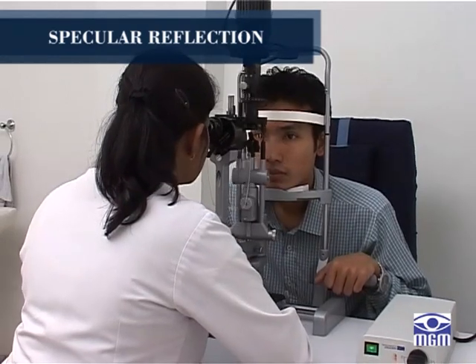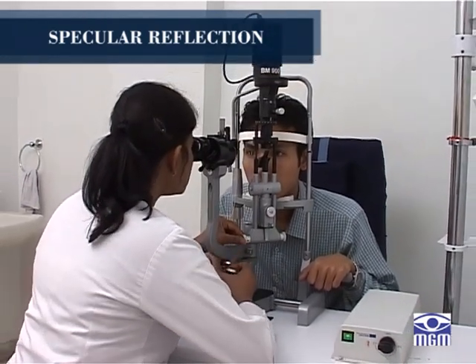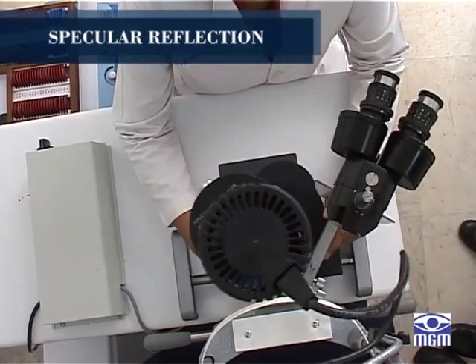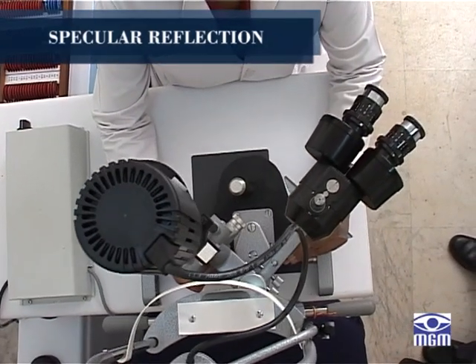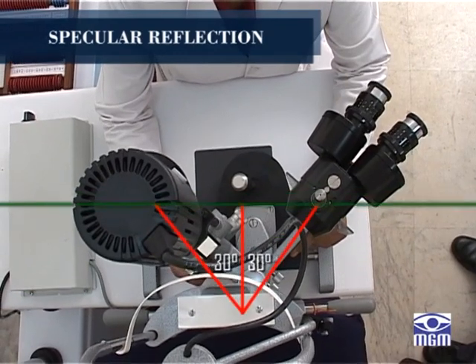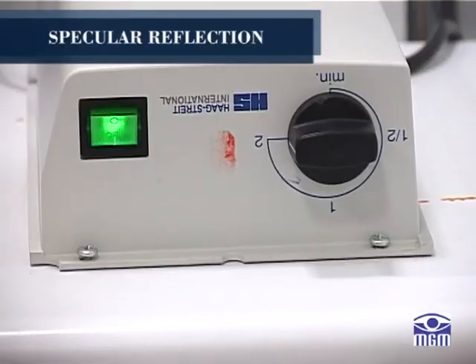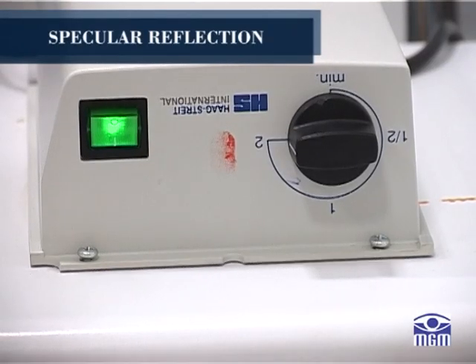In specular reflection, the illuminating and viewing arms are adjusted so that each forms an angle of about 30 degrees to the central perpendicular. The angle between both the arms is 60 degrees. High magnification and illumination are used here.